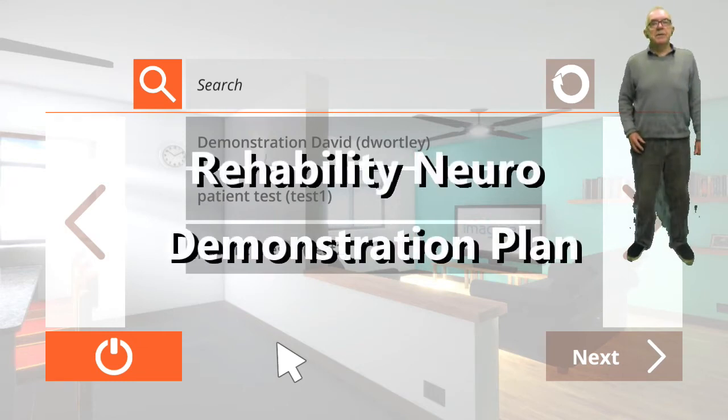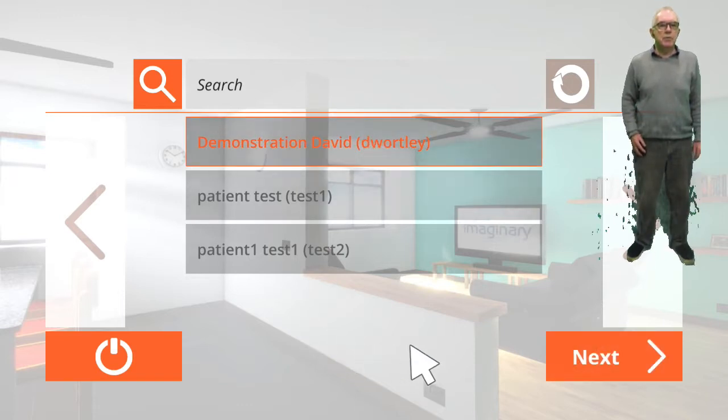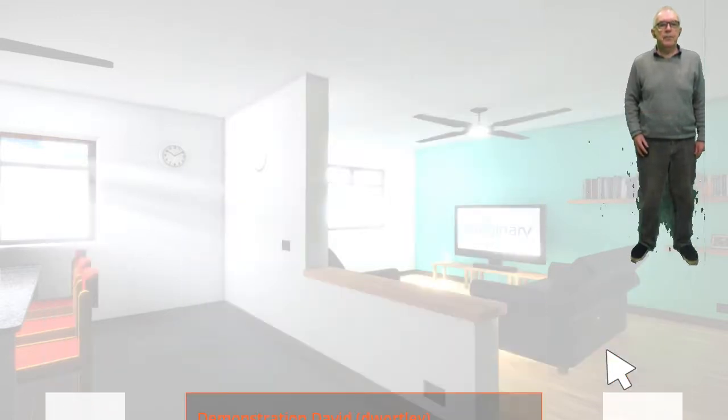Now that we've set up this demonstration plan, I want to demonstrate how it actually works in practice. So I've logged on to the Neuro Rehability program, and I've got to select the plan that I'm using, which is demonstration, David, for myself, and I click on next.